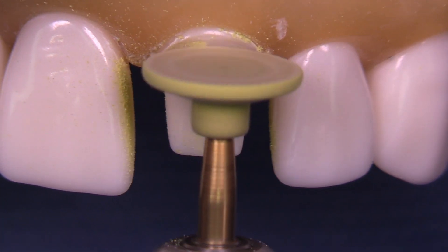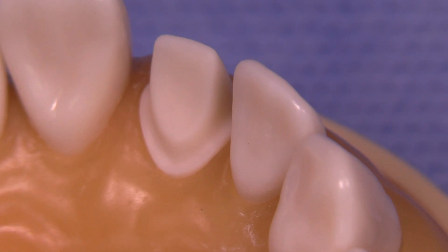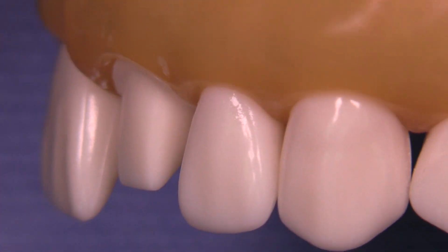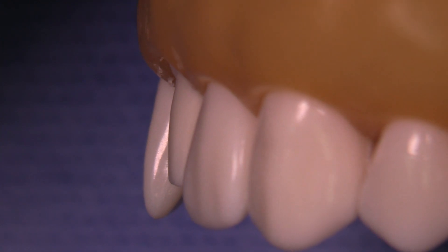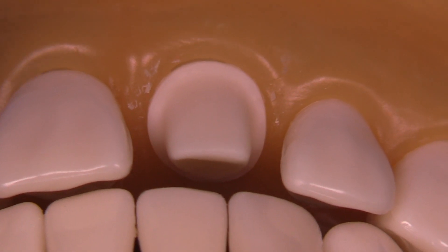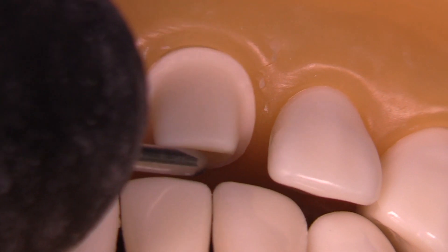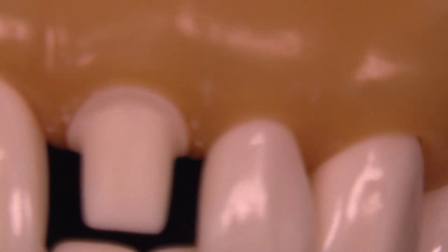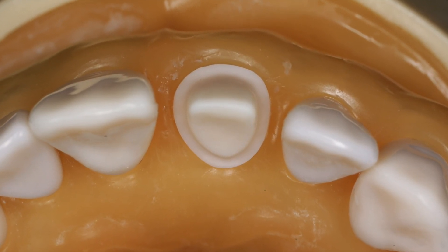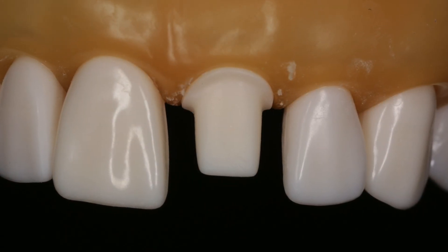Let me know in the comments — I appreciate your feedback and I'd like to know what kind of preps you want me to do and how I can help you in your journey towards excellence in dentistry. Let's take a look at the finished prep and check the clearance underneath. You can see there's a lot more clearance than originally, and this 1.6 millimeter burr shank wiggles a little, which makes sense because we want about 1.5 millimeters of clearance. It's been fun — I hope you enjoyed this video. Let me know what you think and I'll talk to you all soon. Take care!